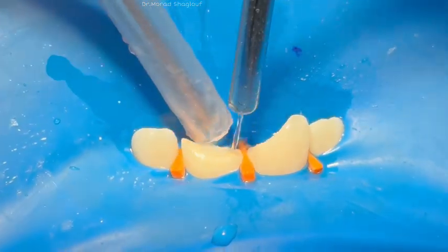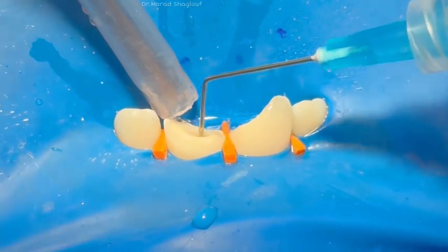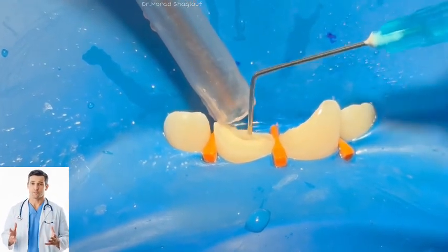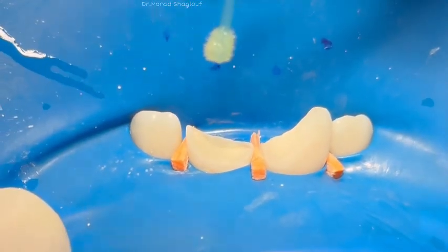Next, the fiber post is tried in and adjusted to the correct length. Once confirmed, it is bonded into place using adhesive cement. This step is critical, as it creates a strong foundation for rebuilding the tooth structure.